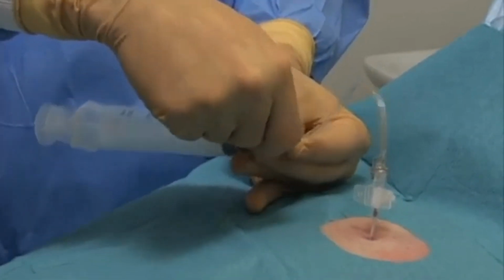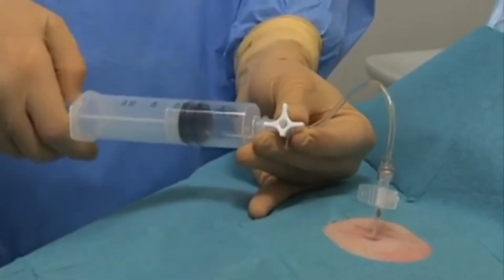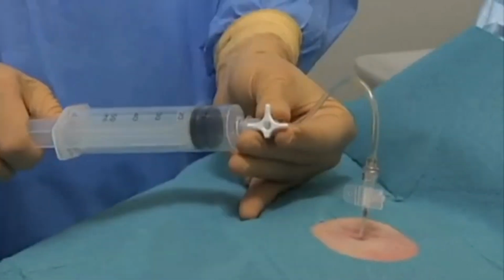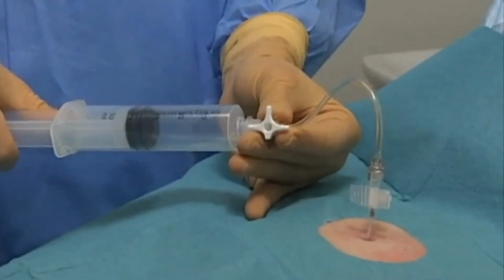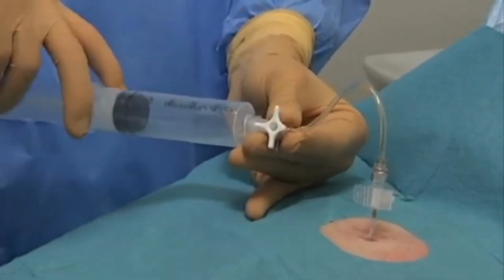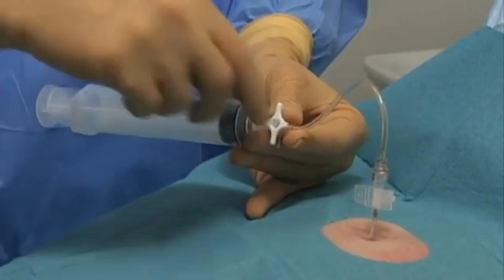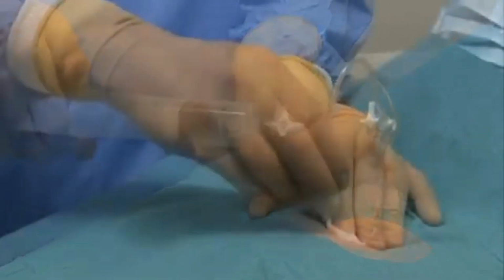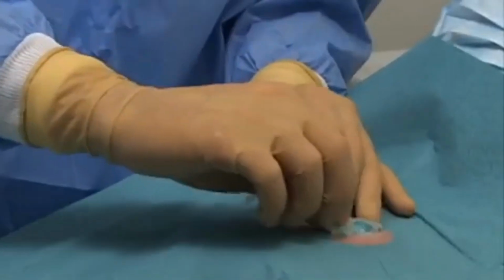The volume of air that is aspirated can be determined by counting the number of syringes evacuated. If more than 2.5 liters have been evacuated, the procedure should probably be stopped because such a large volume suggests that there is an air leak. Continue manual aspiration until you cannot aspirate any more air. Remove the catheter. Put a sterile dressing on the site of insertion. And order a post-procedural chest radiograph to be obtained with the patient in an upright position.